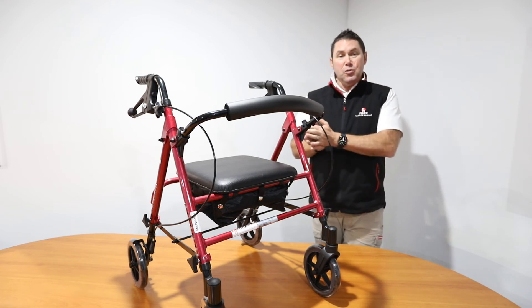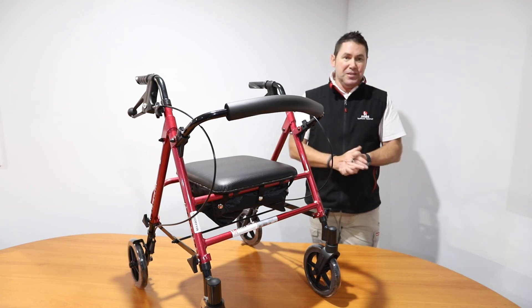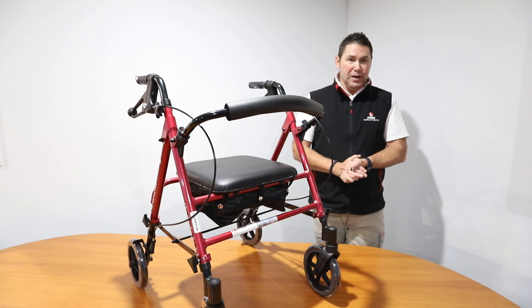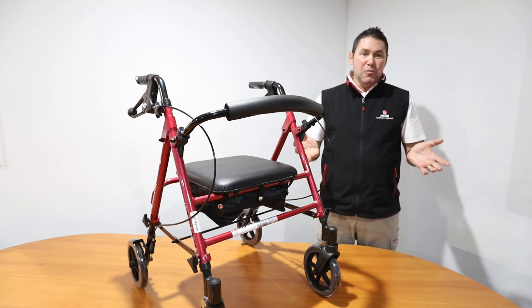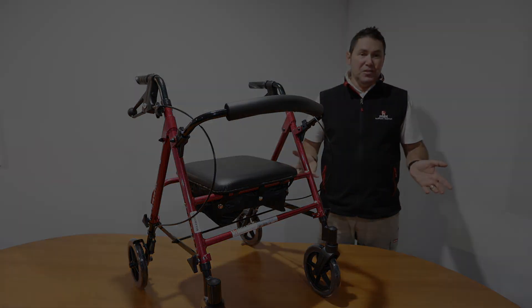We stock these walkers in blue and red, and our staff are always happy to set you up for the right height and the right walker for your needs. Come down and see us and we can walk you through the range of walkers we have here and find one that's just right for you.